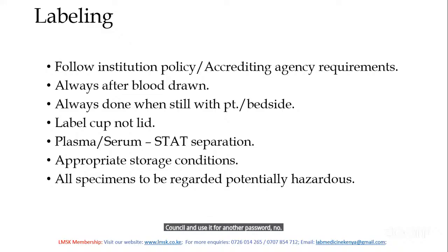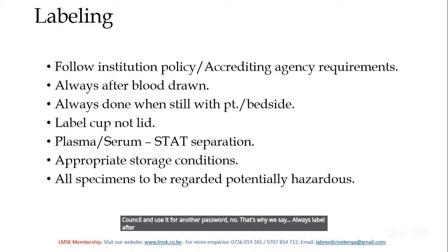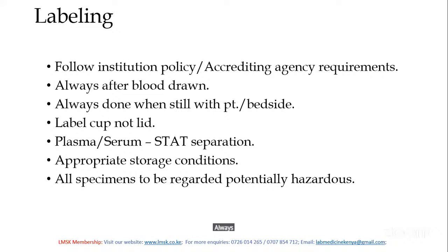That's why we say always label after blood is drawn. Always do it when the patient is still there, at the bedside. Do not label after you've left the patient. Maybe there are some other details you'd like to confirm. Kindly label when the patient is still there.